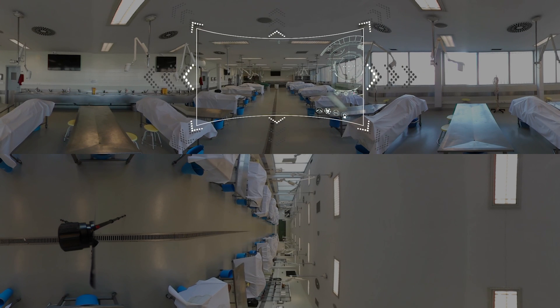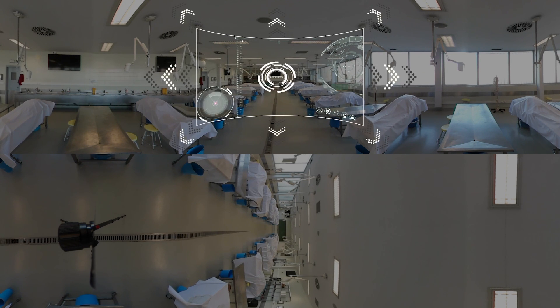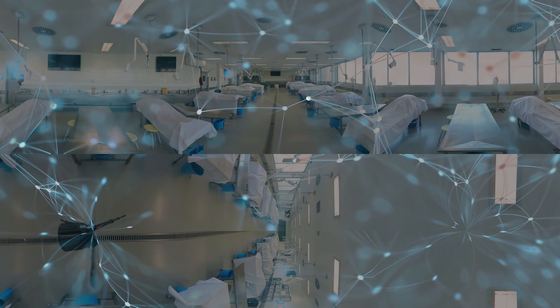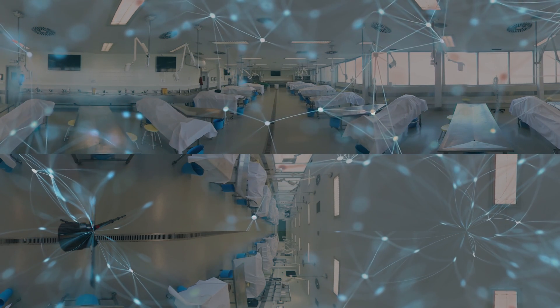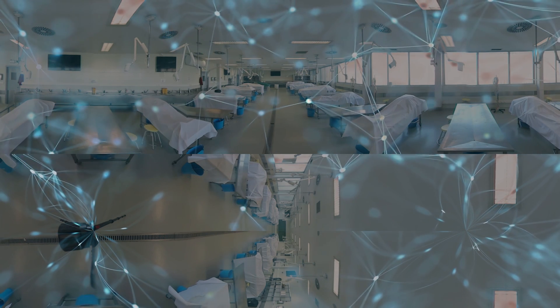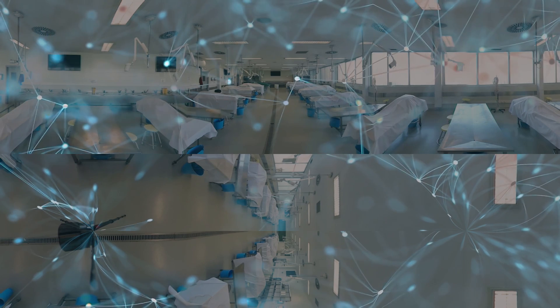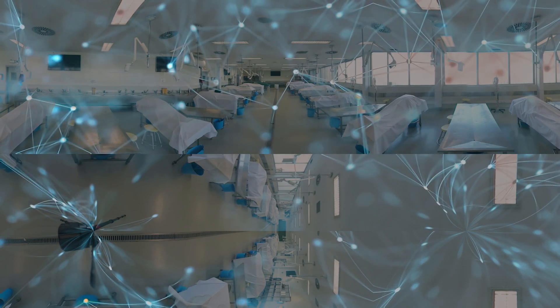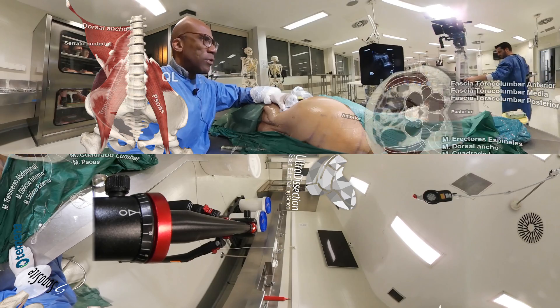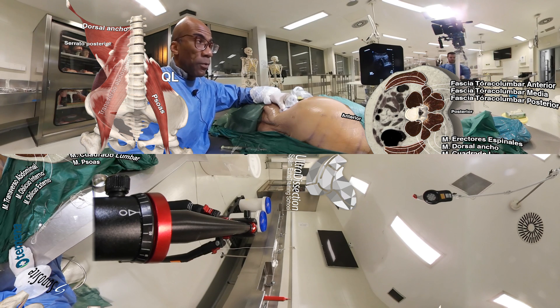You have entered a virtual reality video of ultradissection. Turn around or slide your finger across the screen to see your entire surroundings. We are preparing the systems. The video will start in 3, 2, 1... We are going to make a block of the lumbar quadratus.